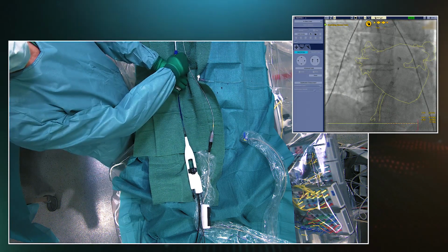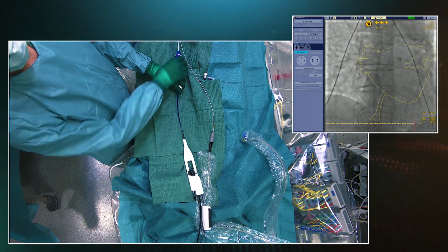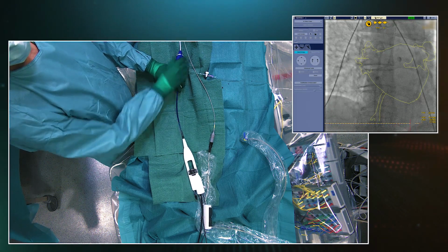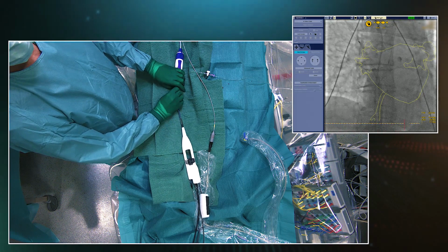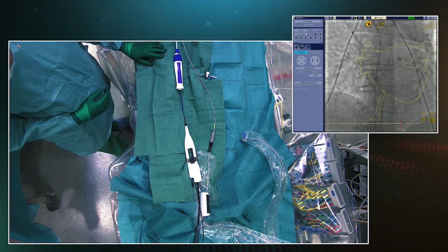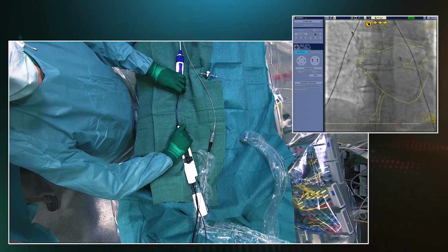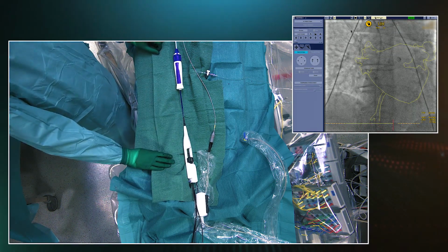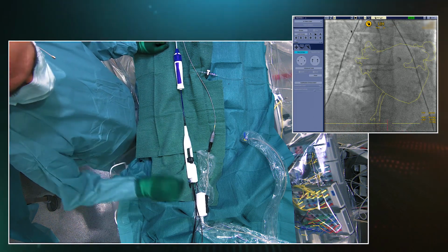This is RAO view. There we go. Now we're pointing to the RSPV. There. Very nice straight path, which is typically the configuration that gives you the best occlusion if you have nice coaxial alignment of the balloon from the steerable sheath right until the distal end. If it looks like this, it's typically easiest to get full occlusion and perfect visualization.